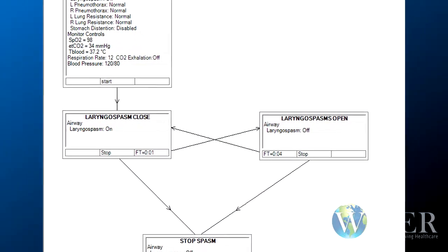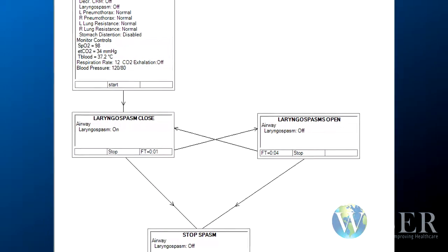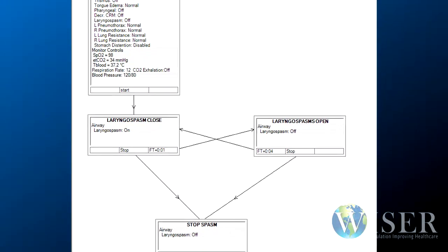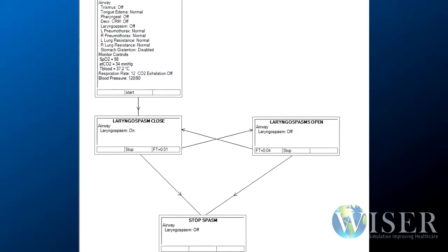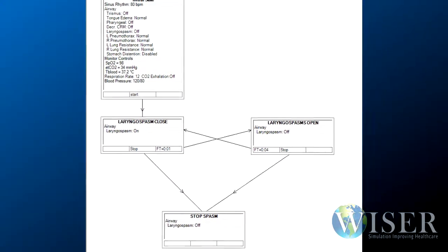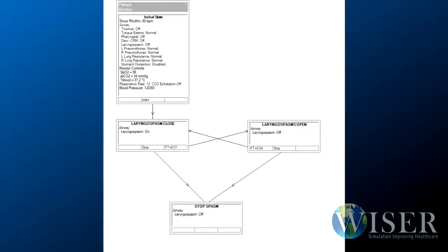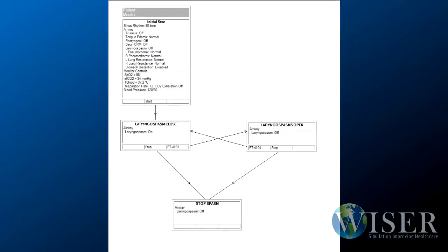There is a simple way to simulate vocal cord movement during an awake intubation. To program the scenario, you have to create a loop of laryngospasms. After the loop is built, it can be applied to the entire scenario and still allow you to change vital signs and other SIMMAN features.